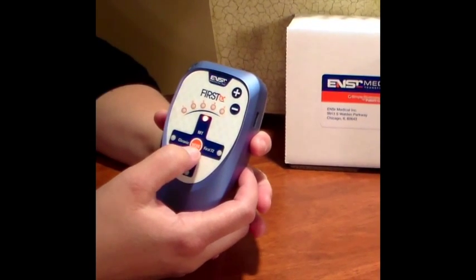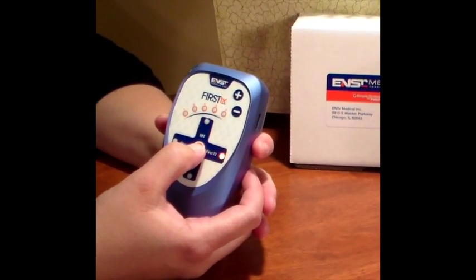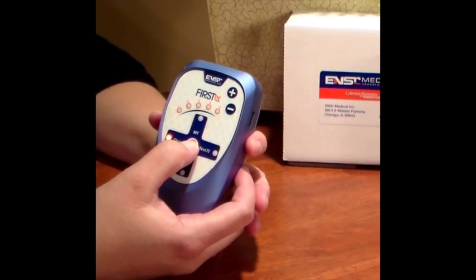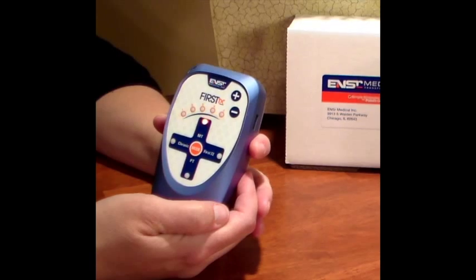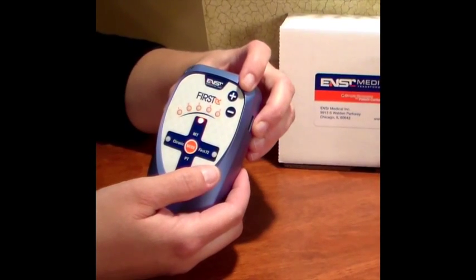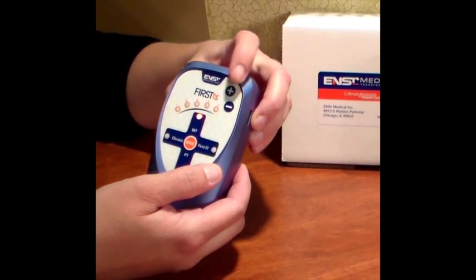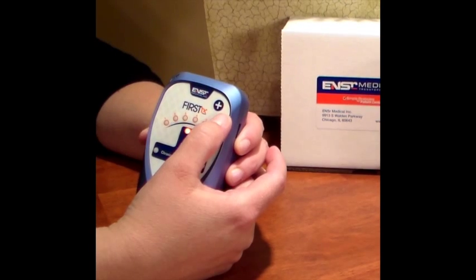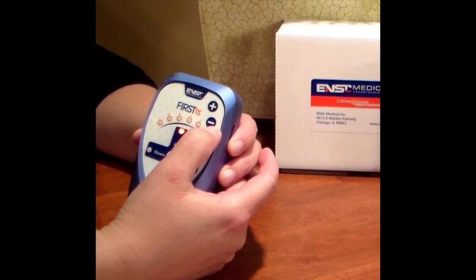The orange button in the center labeled 'mode' helps you select one of the four different functions that you will use during your treatments. We will explain each of the functions later in the instruction. On the upper right-hand corner, you have the plus and minus buttons which help you adjust the intensity or energy level used during treatment.